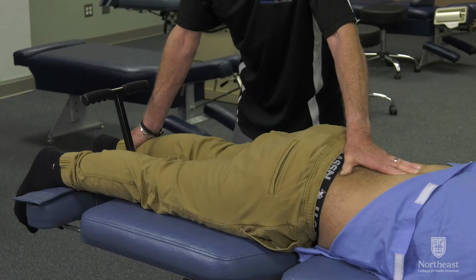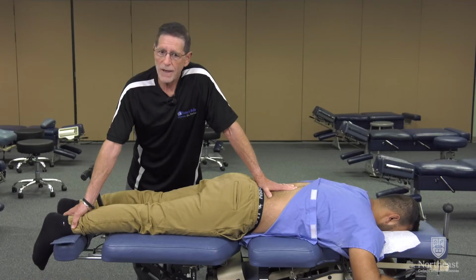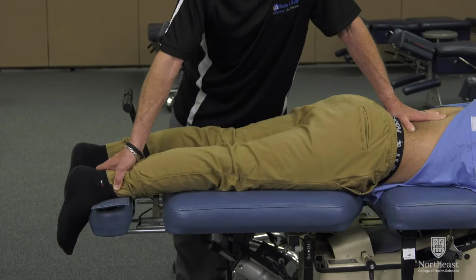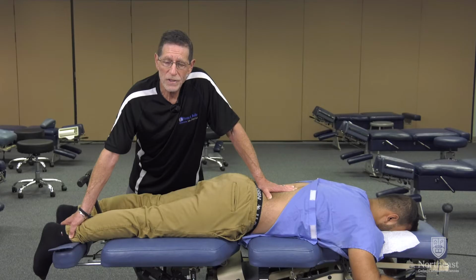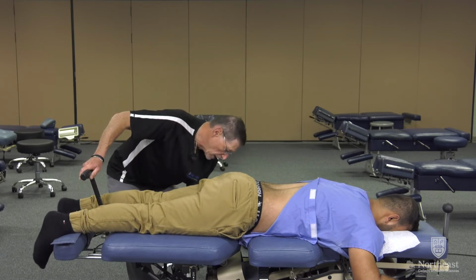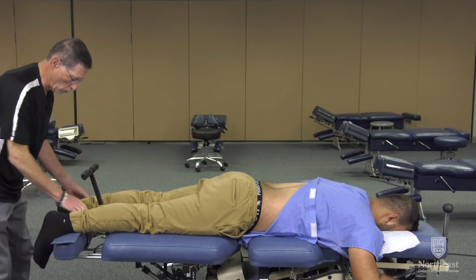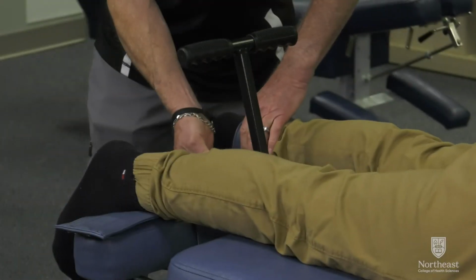If there are none, we'll move over to the right side, so the contact moves over to the right side. And then similarly, we'll lean into that contact to apply decompressive force in a headward direction, and then match the force through the leg. When this is tolerated, we will ease off, then we will lock the table, and then apply the cuffs after permission is granted from the patient, which we already have. So these cuffs are applied in a very snug manner.